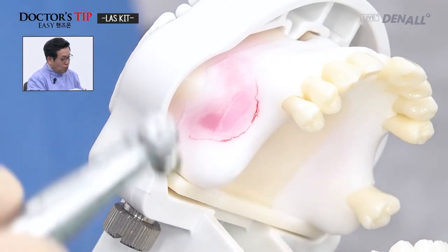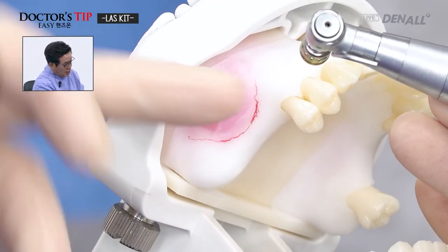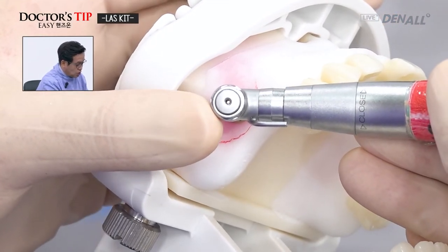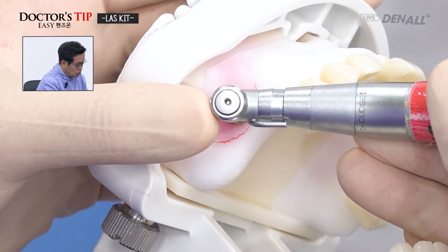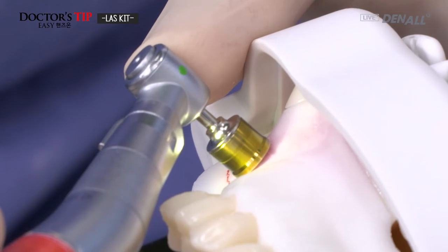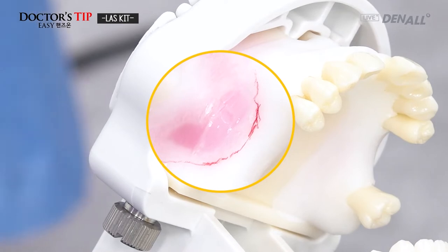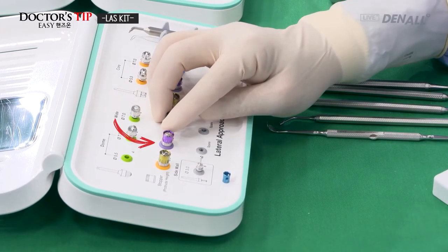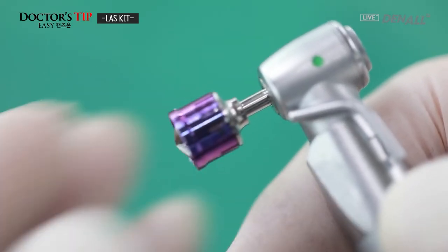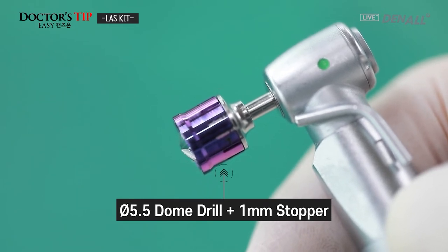But anyway, for the lateral window, leave about a 2 to 3 millimeter gap from the sinus floor and on the front part. I will first form the window with this instrument, like this. It's only 0.5 millimeters. Next, I will use the 1 millimeter stopper. That means you see a bit of the drill blade, like this.